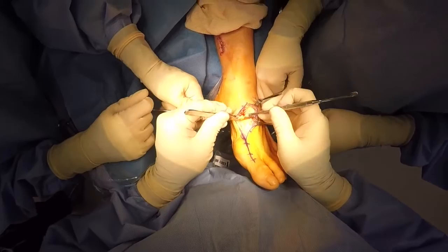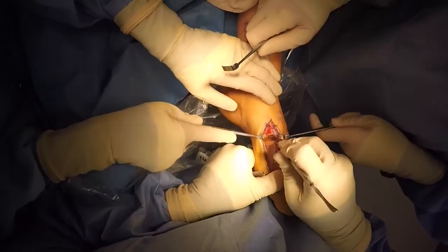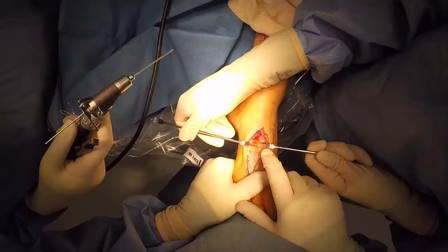Lauren, that's the best cut I've seen yet from a resident. So you see these little white fibers down there? No. They're down there, plantar lateral. Plantar lateral first metatarsal. I see yellow fluid, that's all. So this is second metatarsal that you gouged a little bit over here.